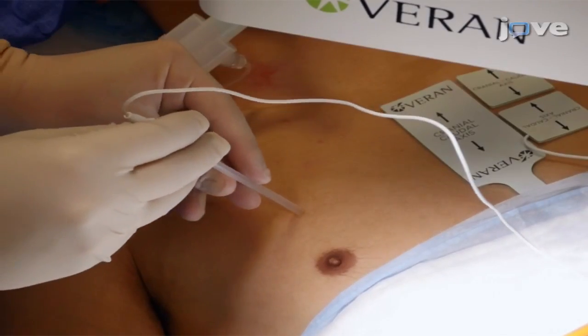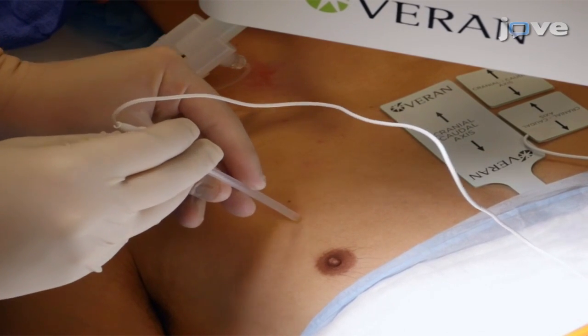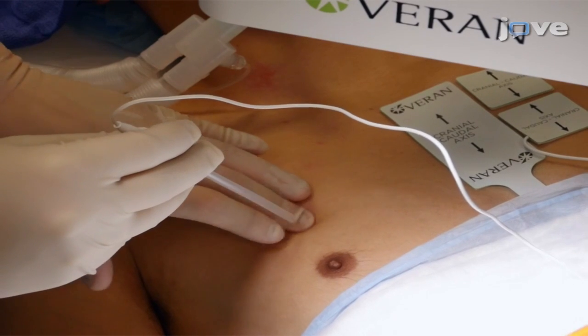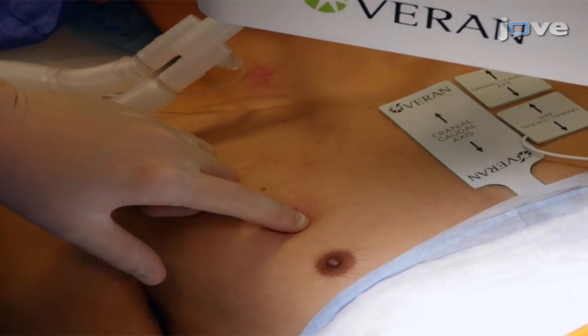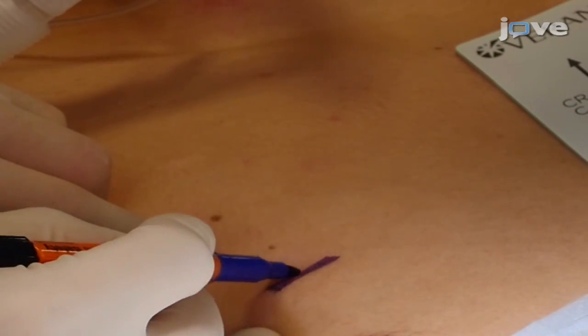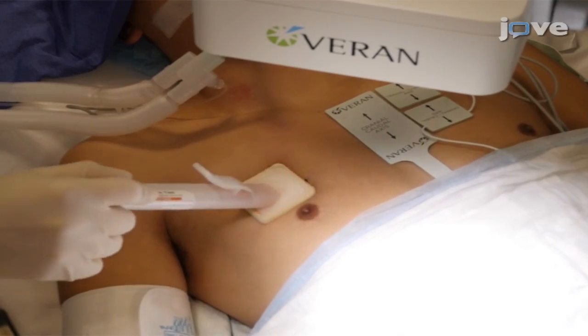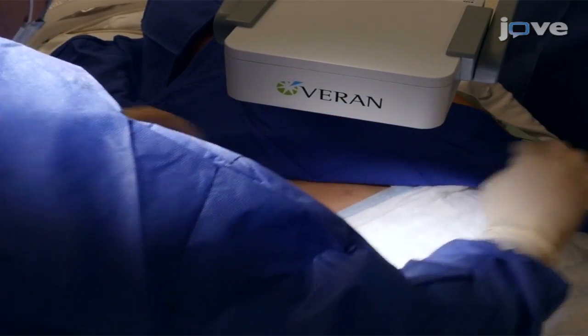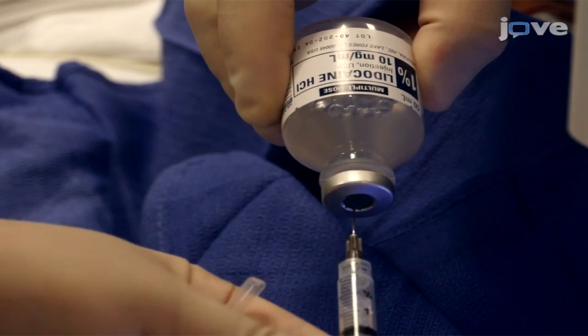Using a test electromagnetic navigational needle, select an entrance point on the chest cavity that is superior to the surface of the nearest rib while avoiding osseous and vascular structures. Mark it on the skin surface. With a 2% chlorhexidine solution, prepare the skin and use a sterile technique to drape it. Then administer a local anesthetic.